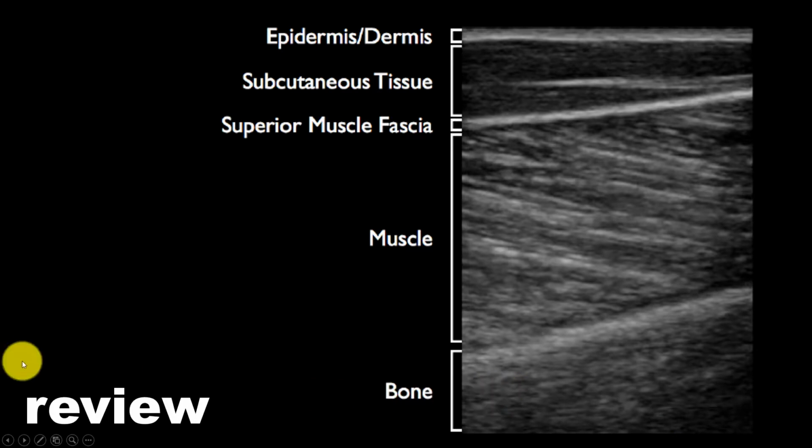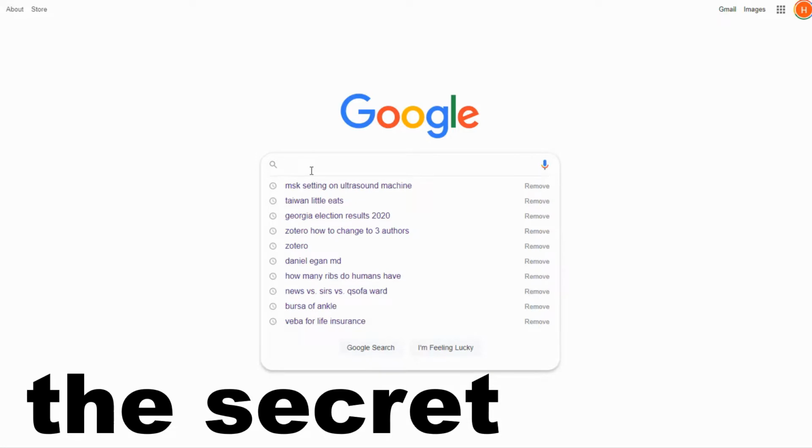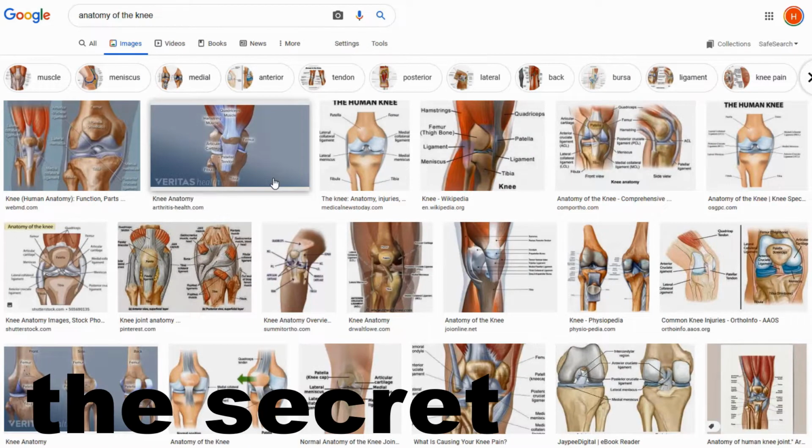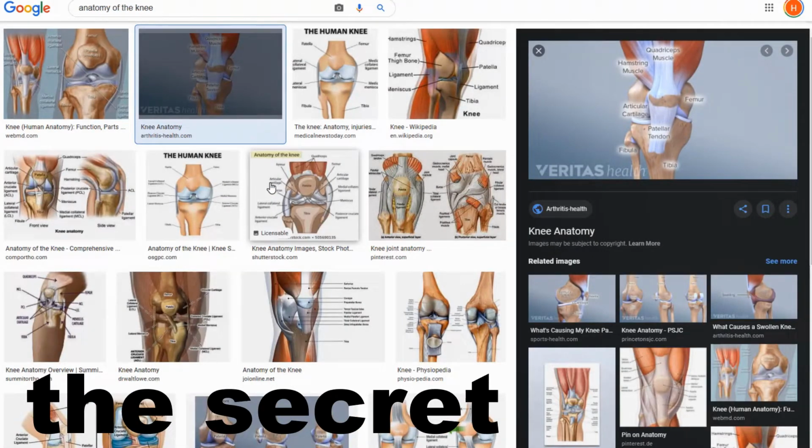When we're doing musculoskeletal ultrasound, you really want to pay attention to the muscles and the bones, but also know that some of the tendons are actually pretty superficial structures and may sit towards the top of the screen here. It's important to know your anatomy wherever you're scanning and what is in the area of interest or in the area of the patient's pain. And honestly, I'm not by any means an anatomy expert. I often have to look this stuff up too. So if I know that I'm going to do this exam, I'll actually quickly look up an image of where the tendons insert, where the bursa of that joint are, etc., so that I know what I'm getting myself into.